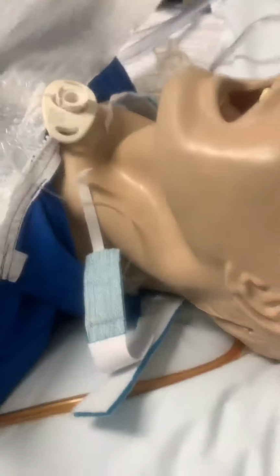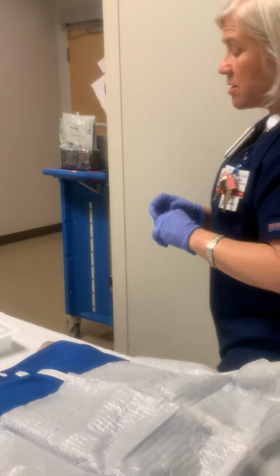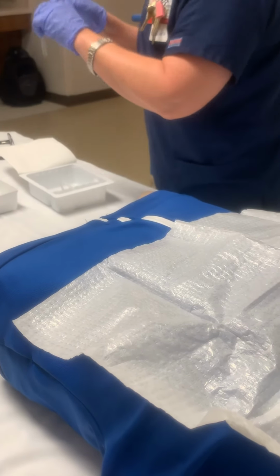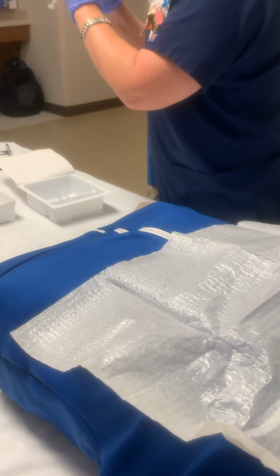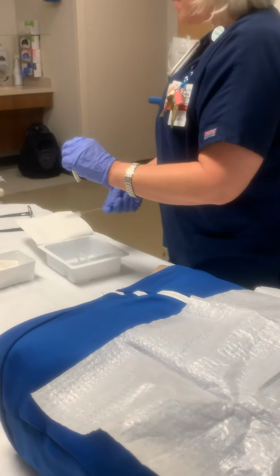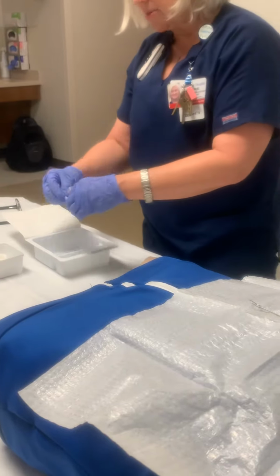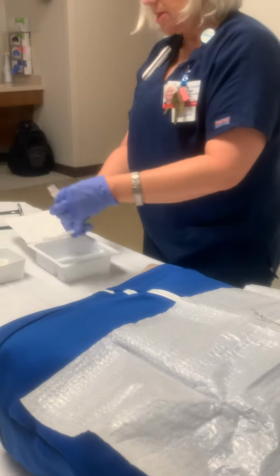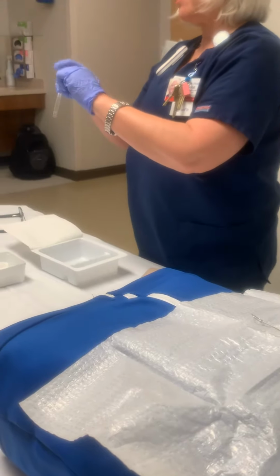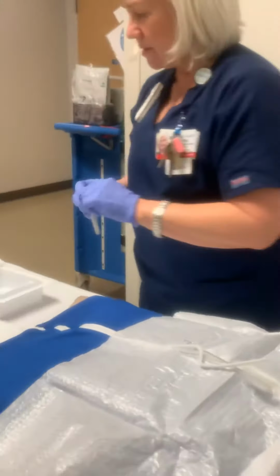If it's disposable, which almost all of them are nowadays, dispose of it and get a new one. If they are not, you're going to have to put it in here and use your pipe cleaner to clean your inner cannula. I don't like to put it back here, don't do that. I'll just throw it in my discards here. You've also got some more pipe cleaners right here that you can use. I'll dip it again, use my pipe cleaner again and clean it, then discard it.